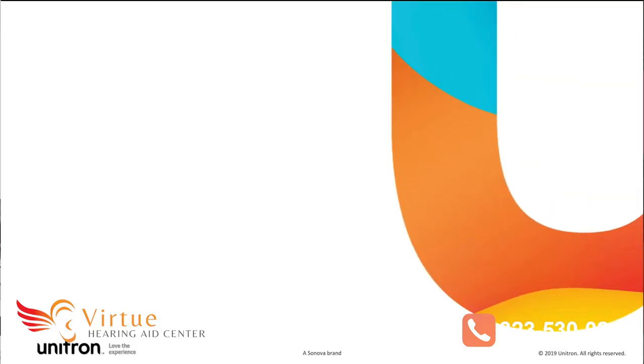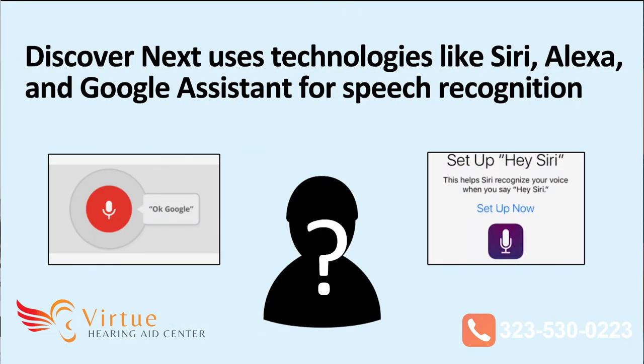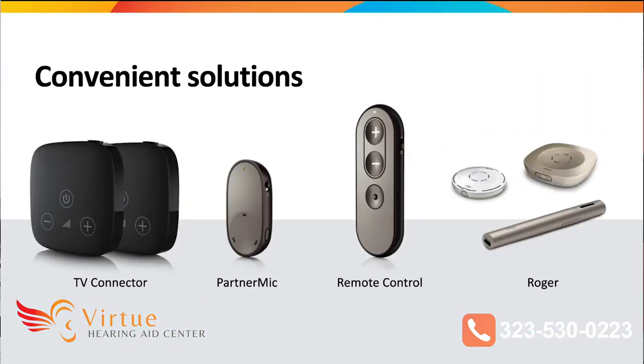So this is Discover Next Move — beyond the words. One cool feature is that now if you have your hearing aids connected to your Android or Apple iPhone, you can say, for example, "Hey Siri," and your hearing aids will activate your virtual assistant, which can be very helpful.